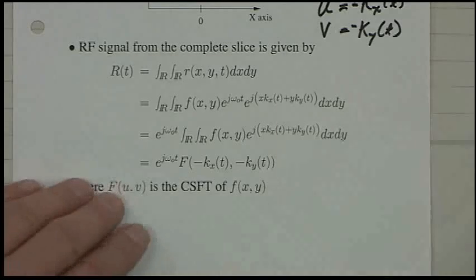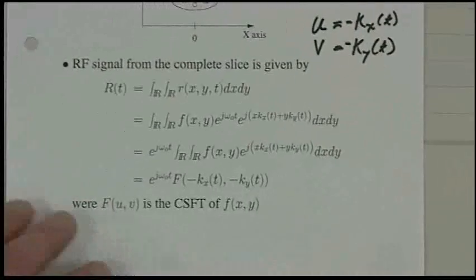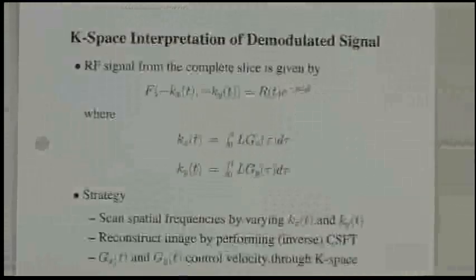So what we're doing in MRI is we're literally taking your Fourier transform. So if you ever get an MRI scan, you could say, they're taking my Fourier transform, and that's what would be happening. Your Fourier transform is being taken. I hate it when people take my Fourier transform.